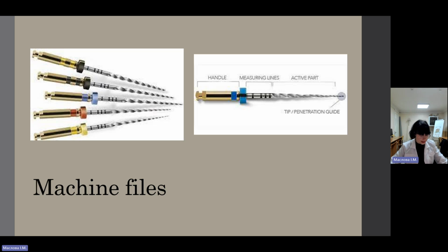Helical flute angle. This is the angle at which the cutting flutes spiral around the shaft of the instrument. If there are too few spirals, the debris will accumulate quickly before being removed, and the instrument will become clogged. On the other hand, if there are too many spirals, the debris has too great a distance to travel before being evacuated, and frictional resistance may trap and compress the debris. The ideal helical flute angle allows efficient removal of the debris without clogging the instrument.